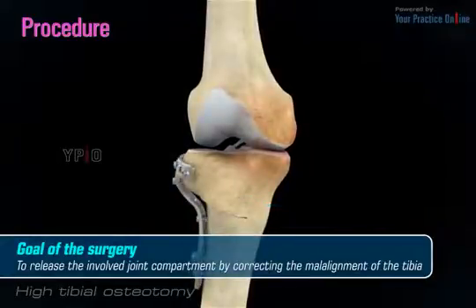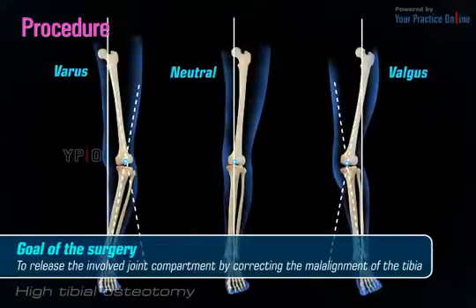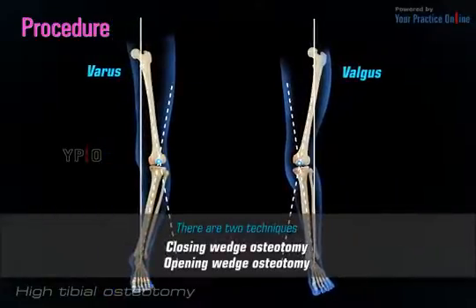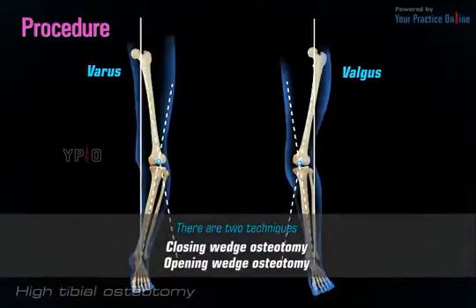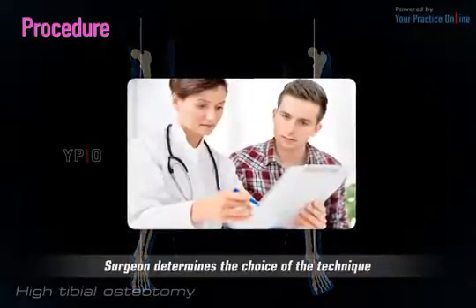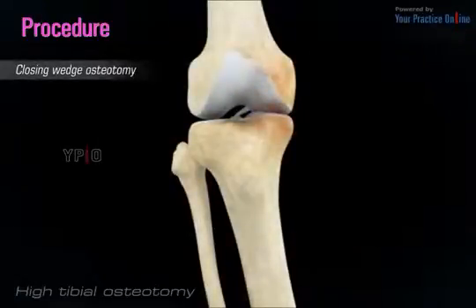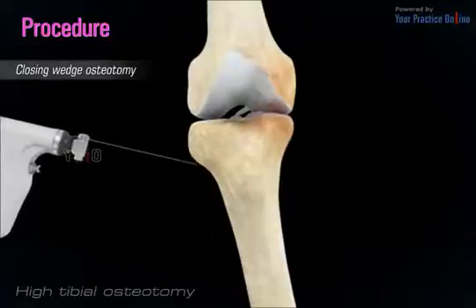The goal of the surgery is to release the involved joint compartment by correcting the malalignment of the tibia, and to maintain the joint line perpendicular to the mechanical axis of the leg. There are two techniques that may be used: closing wedge osteotomy and opening wedge osteotomy. The surgeon determines the choice of technique based on the requirement of the patient. Closing wedge osteotomy is the most commonly used technique to perform high tibial osteotomy.